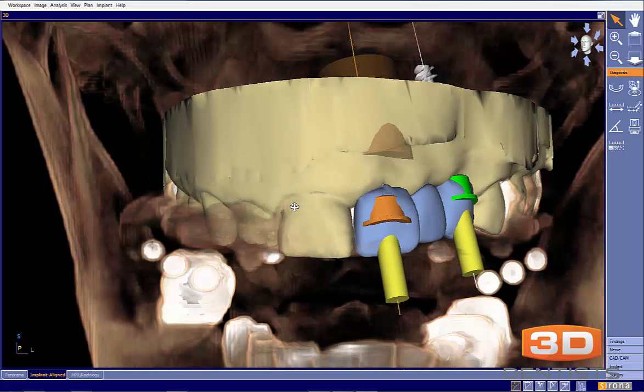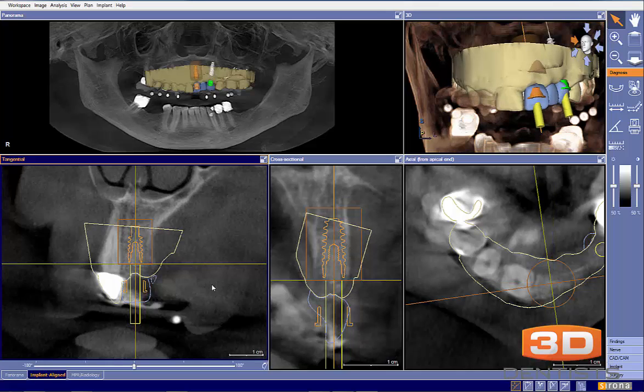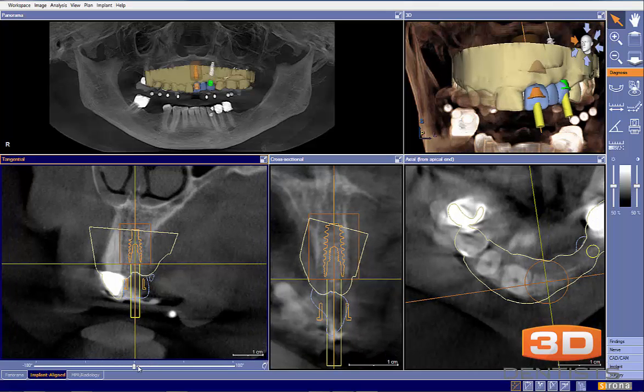It's not always fixable, but I'm looking at the axis of the implant, and we know that our tooth is coming this way. So from an occlusal perspective, I'd like to have my implant restorations, or my implant placement, properly support the occlusal plane.